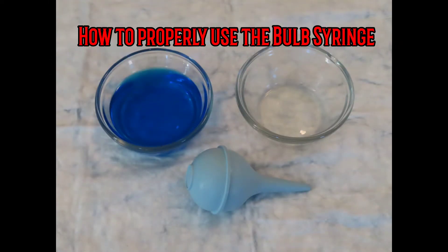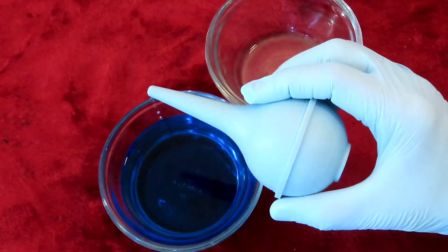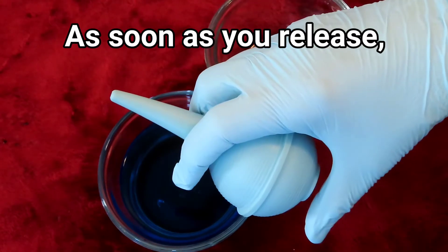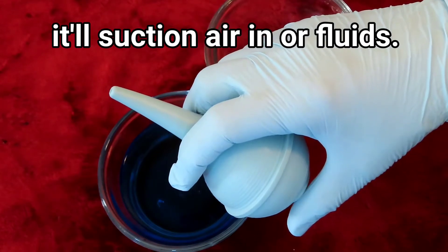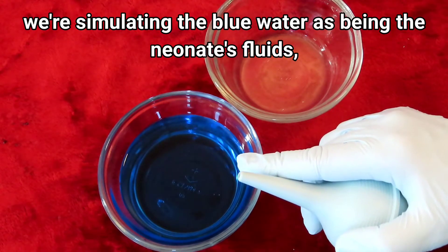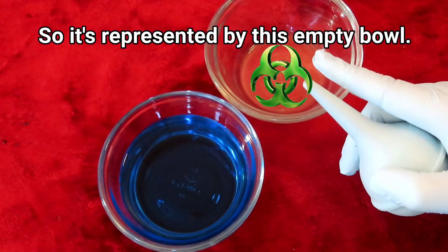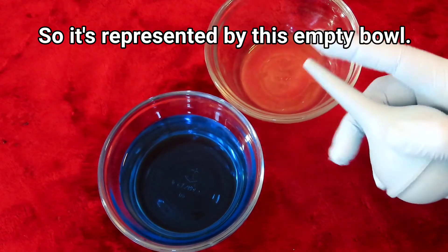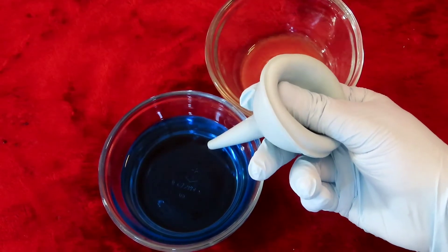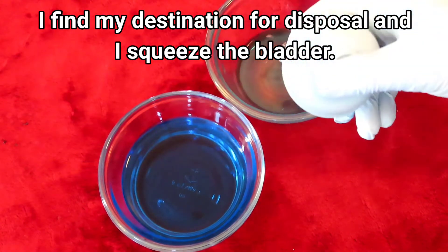How to properly use the bulb syringe: squeeze the bladder to push air out, then release to suction fluids in. In this demonstration, blue water simulates the neonate's fluids, and an empty bowl represents the biohazard disposal destination. Squeeze the air out, enter the orifice, suction some of the fluids, then move to the disposal destination and squeeze the bladder to expel.